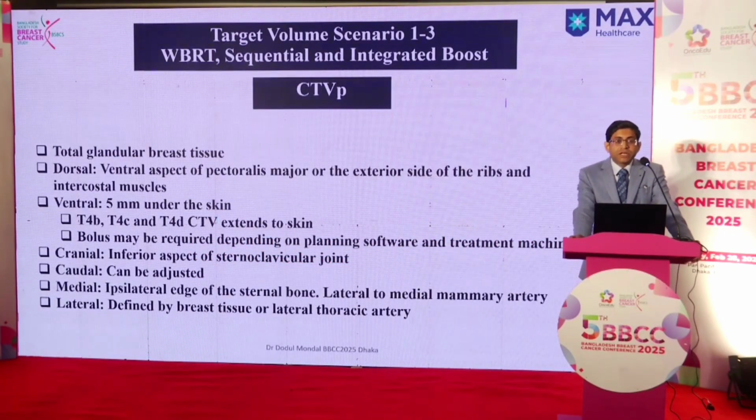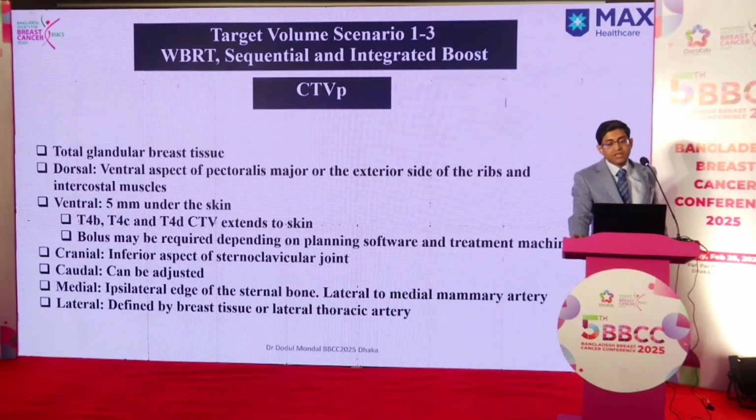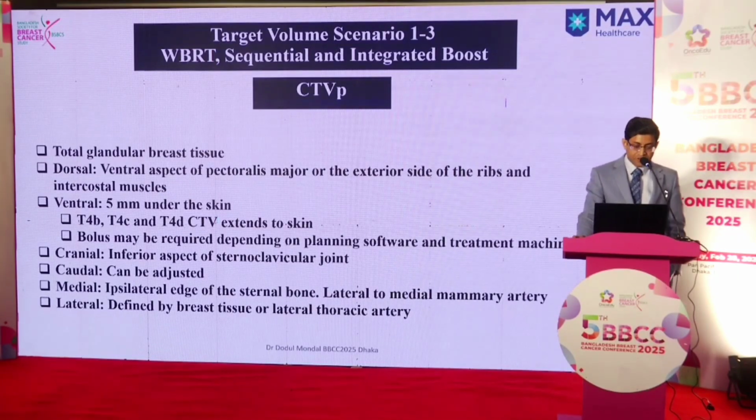Now, the clinical scenarios, I have grouped 1, 2, and 3. That means the breast cavity together, whole breast, sequential, and integrated boost. Now I have clubbed them together because the target remains the same whether you are going ahead with sequential boost or you are going ahead with the integrated boost. So that does not change.